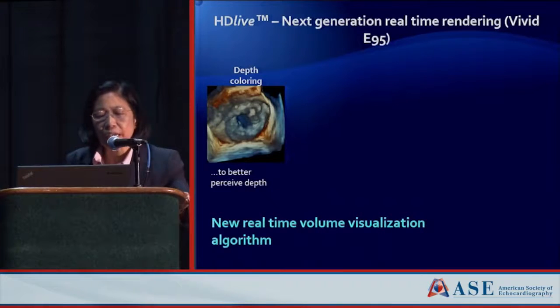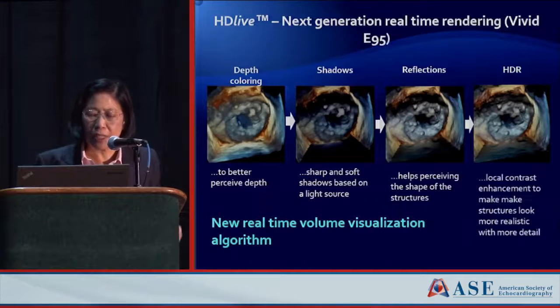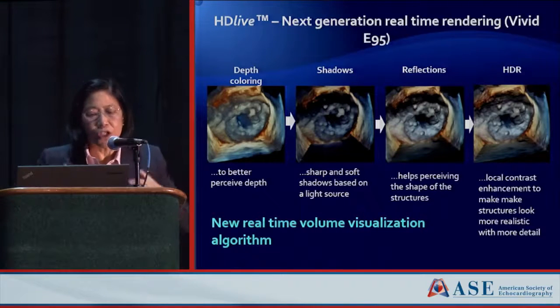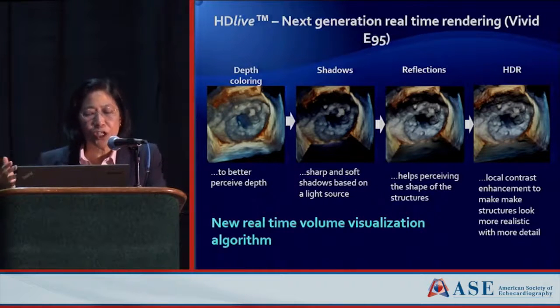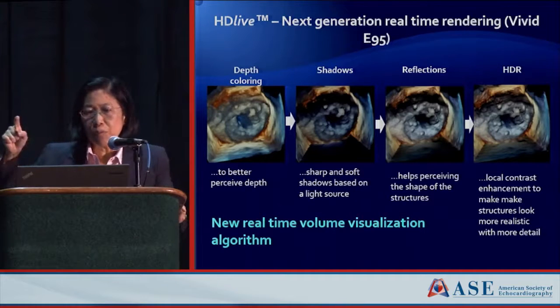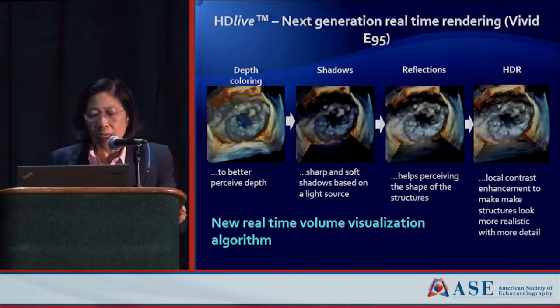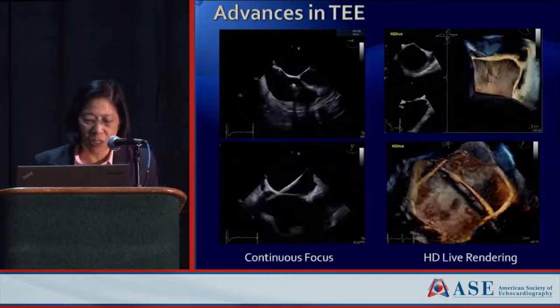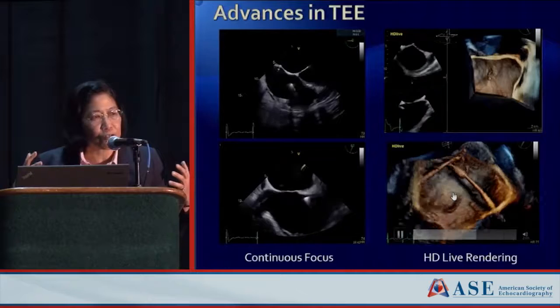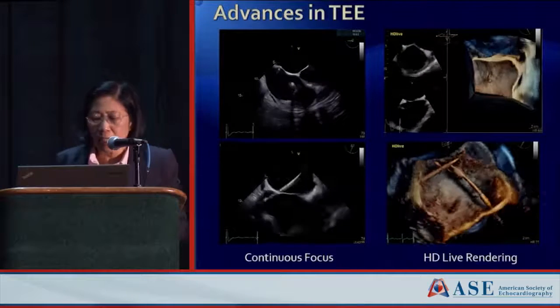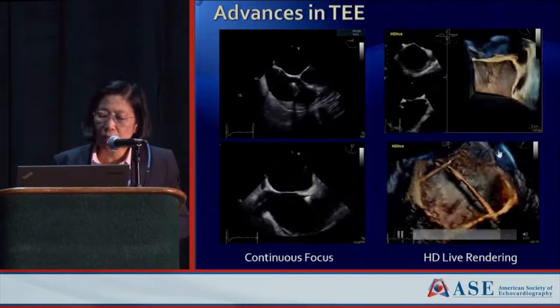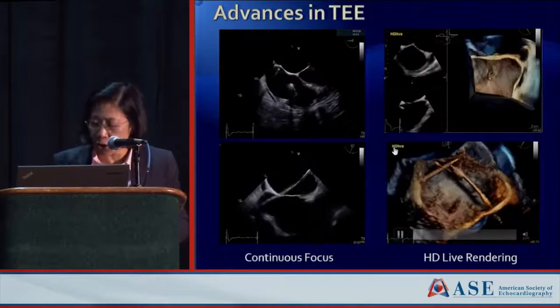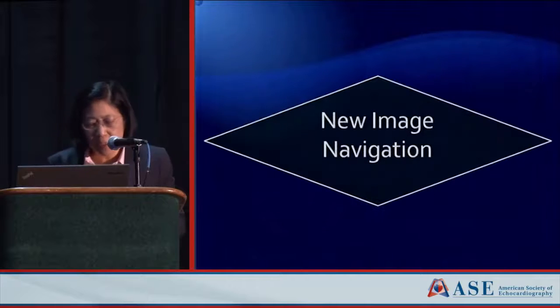HD Live is just fascinating. Because you can look at a pixel from multiple different views within the volume, you can change the depth coloring, shadowing, reflections, and light source — pretending the light comes from the left, right, above, or below. All of these things change how we see structures within the volume. It will help us look at catheters and defects differently. Here the light source is coming from the upper right-hand corner, but you could change it to the other side and the shadow would shift — all enabled by the software beamformer.